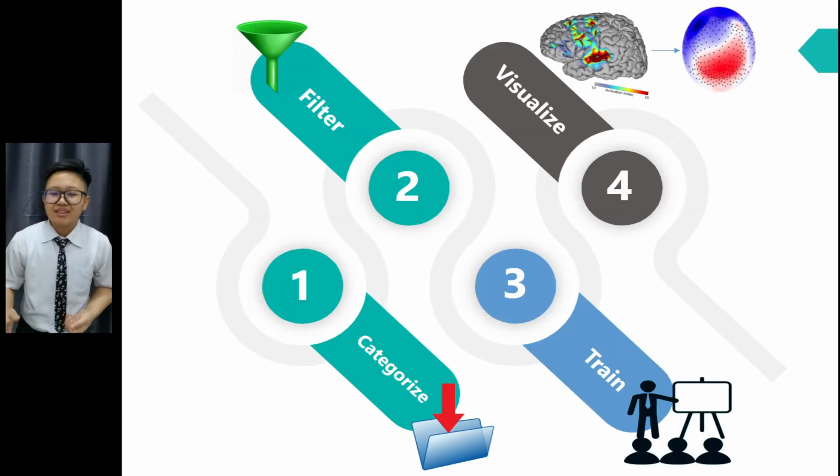I will be working at the Center of Artificial Intelligence and Robotics Research Department and utilizing the BR32S BCI to extract EEG data from 6 individual subjects. Firstly, the signal data obtained is split into 2 categories, which are feature representation and training specification.